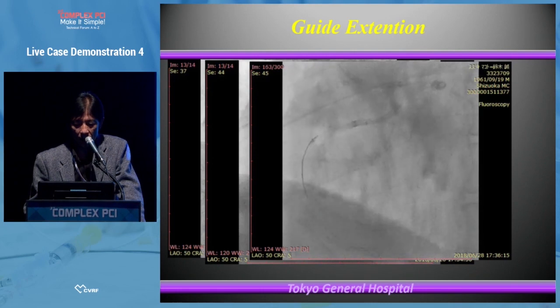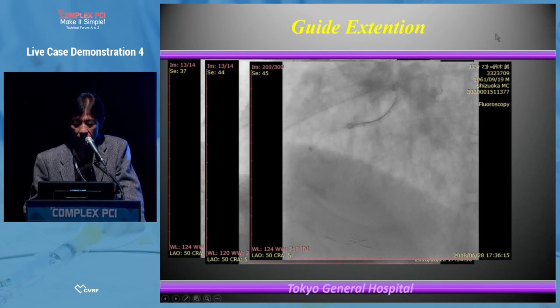It is relatively easy to get the retrograde wire in.